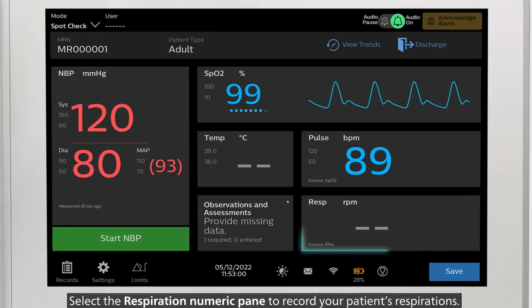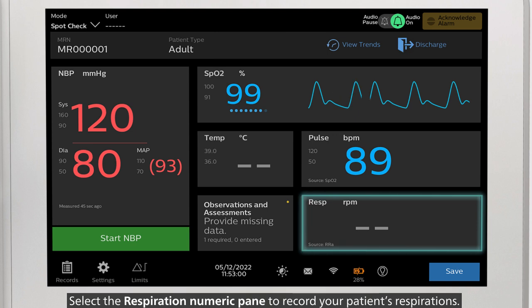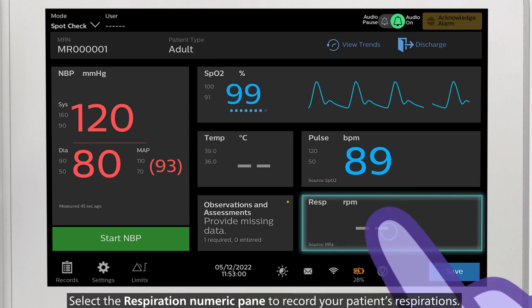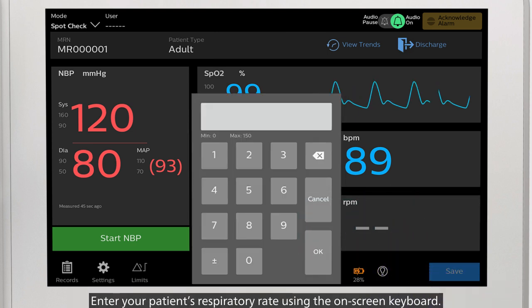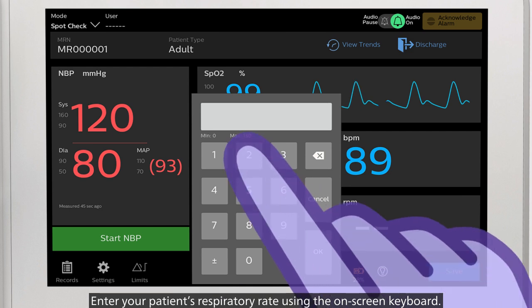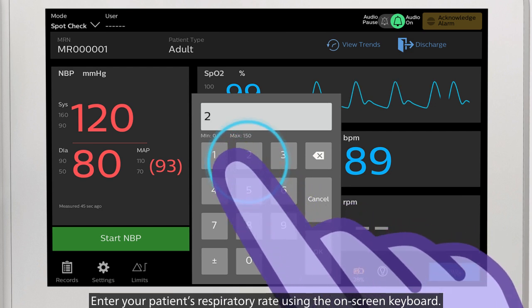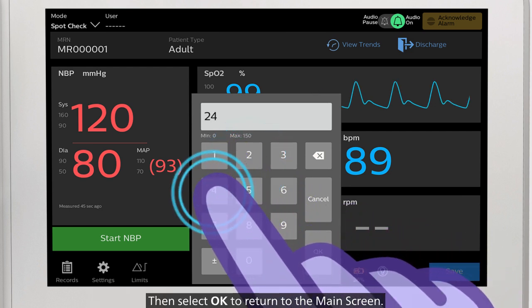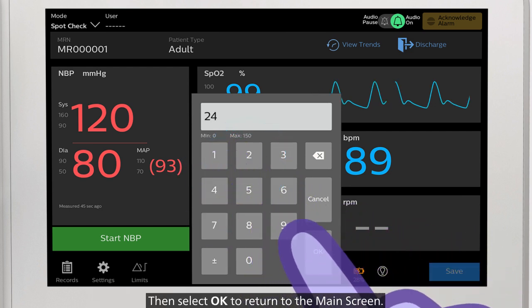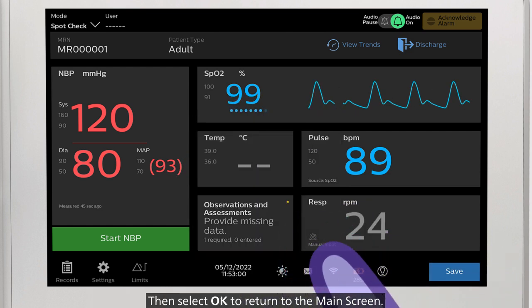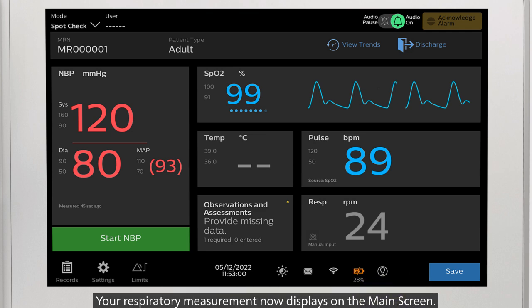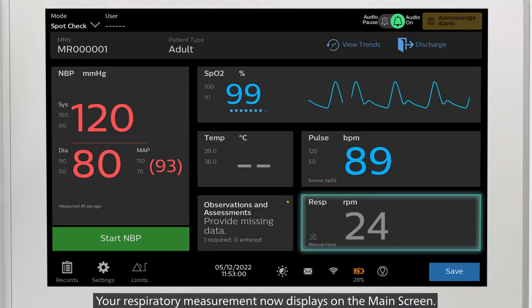Select the Respiration numeric pane to record your patient's respirations. Enter your patient's respiratory rate using the on-screen keyboard, then select OK to return to the main screen. Your respiratory measurement now displays on the main screen.